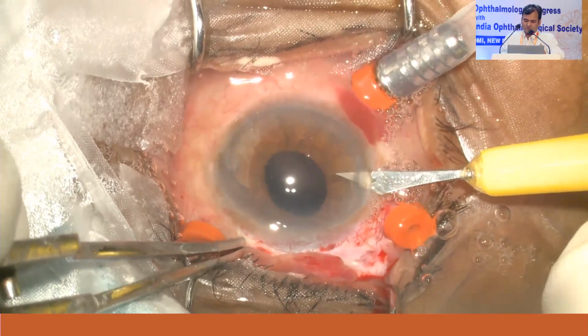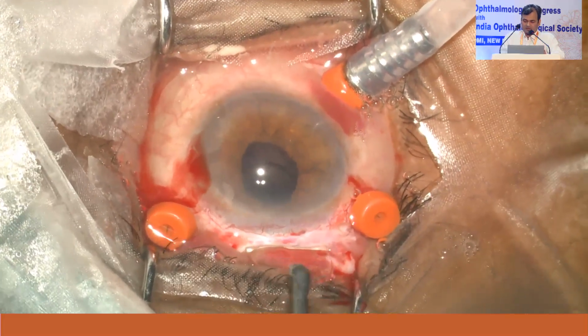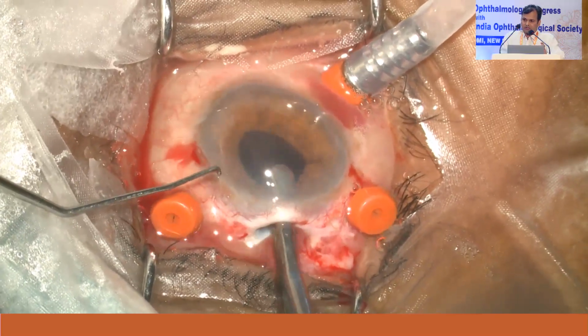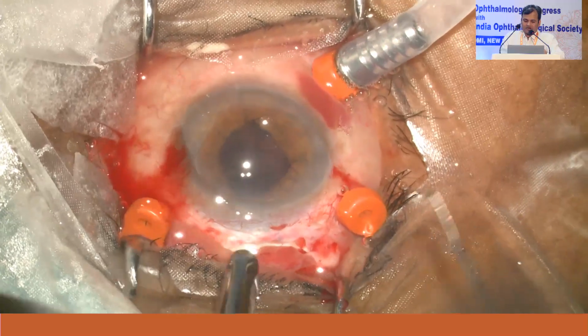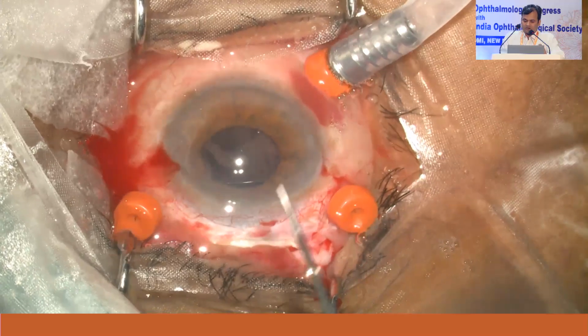In this way, you also avoid complications if some peripheral vitreous is still there, because if you are using a phacofragmatome, the opening of the fragmatome is so big that sometimes you may catch the vitreous and complications like a tear or detachment may happen. Sometimes if your chamber is not maintained, your eye may collapse while using a phacofragmatome.